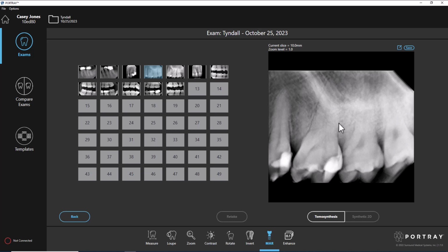Now, think about when it rains. At first raining, you look at the sidewalk or the street, and you see just splotches of water. That's being underexposed, but you get more rain, and then it becomes more smooth. So it's certainly a good idea to set the exposure levels higher if you're in the posterior, certainly higher than your anterior projections would be.